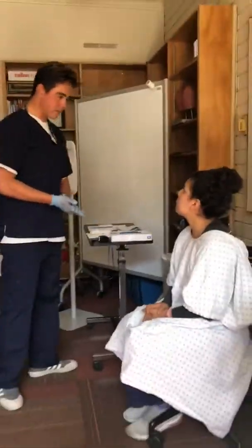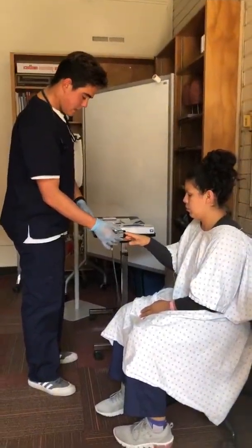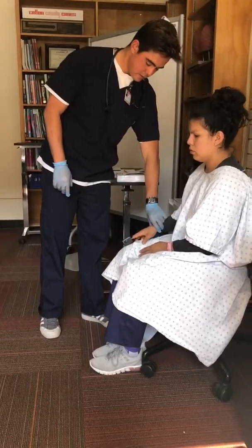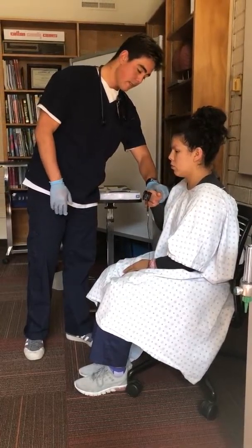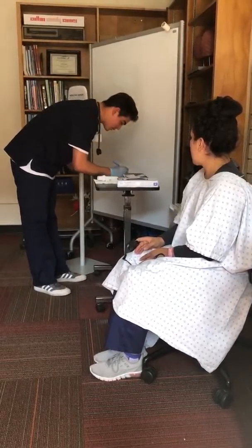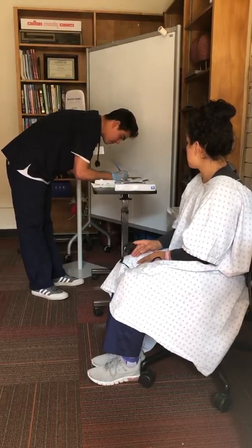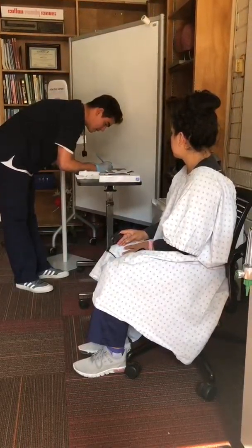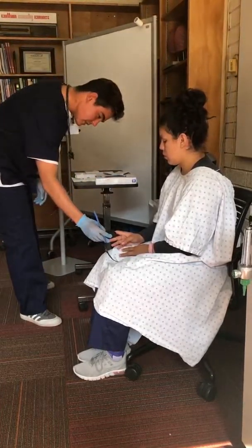So we're going to go ahead and reassess some of your vitals that we did before, okay? I'm going to have you put your finger into here. Thank you. Okay, so we're gonna get that measurement. I'm gonna go ahead and take your pulse again. So same thing, 30 seconds of respirations, 30 seconds of pulse. Okay. We got a pulse of 30 again, so we'll multiply it by 2, it's gonna be 60 beats per minute. Our respirations were lowered to 7, so it's gonna be 14 a minute. Okay, and her saturation is still at 98%.